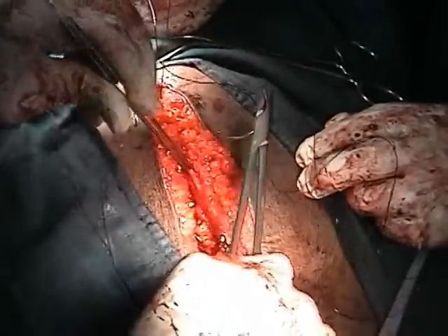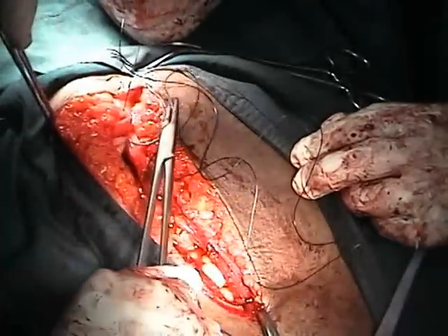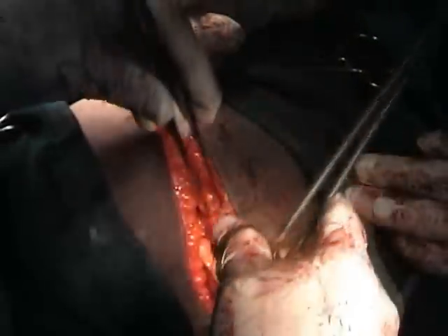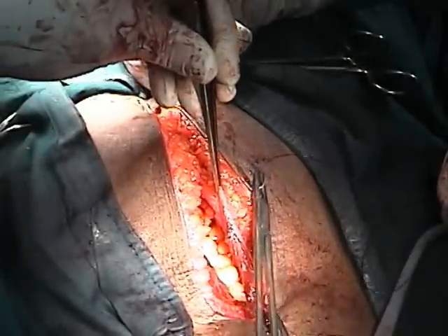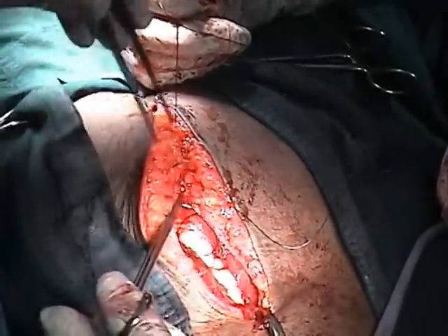And one complication that could occur at this stage of the operation, if one's not careful, is that in placing the suture through, the surgeon could pick the bowel and then eventually result in a fistula between the bowel and the skin, an enterocutaneous fistula. So the surgeon needs to be careful that the needle is not placed in too deep or placed in blindly, so that it ends up picking bowel.